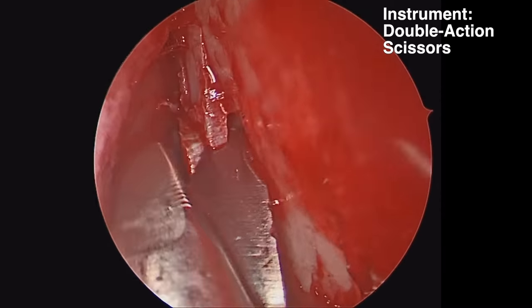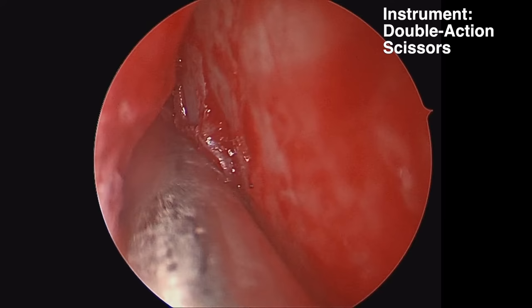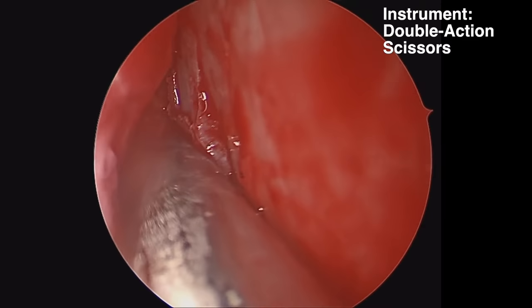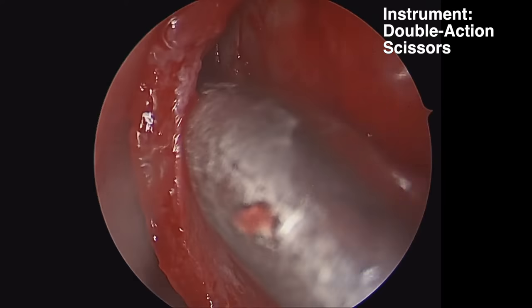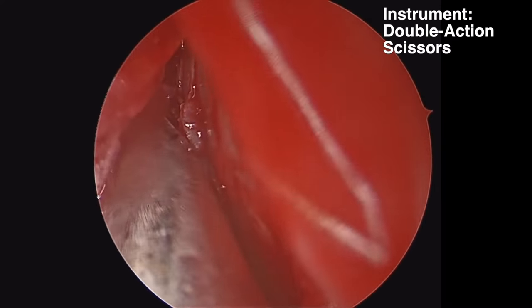When you're doing an endoscopic septoplasty, you can tailor your chondrotomy and osteotomies to just remove the portion of the septum that is deviated. The endoscope allows you to better visualize just the portion of the septum that you need to remove.